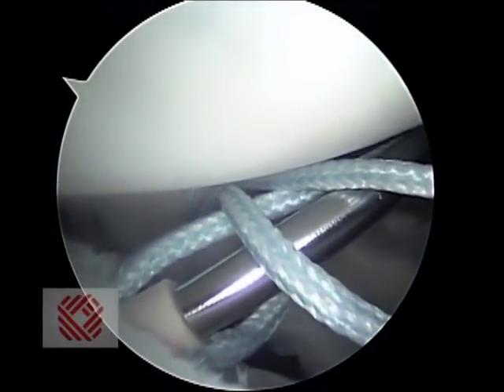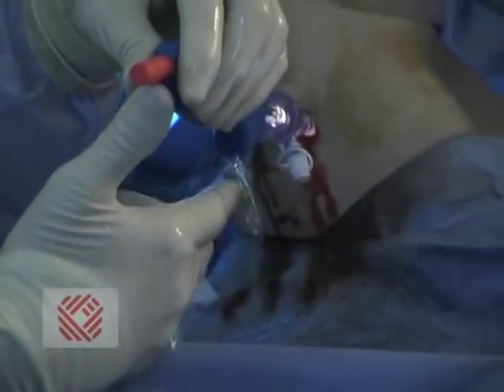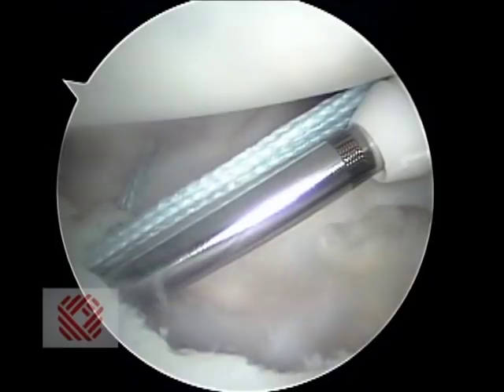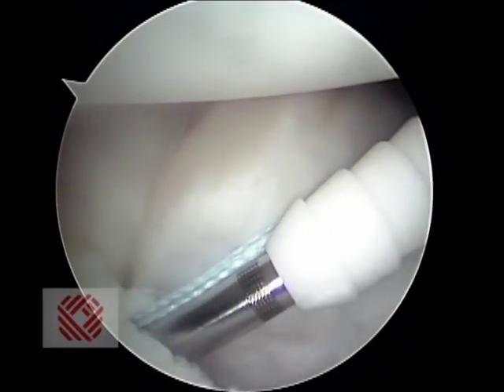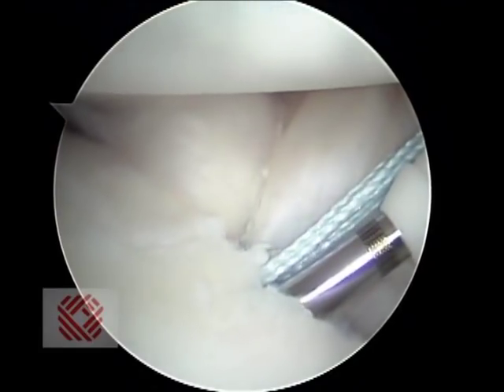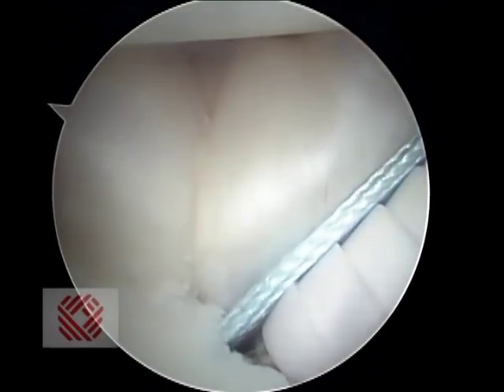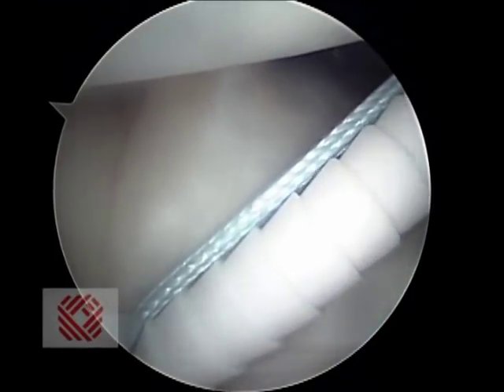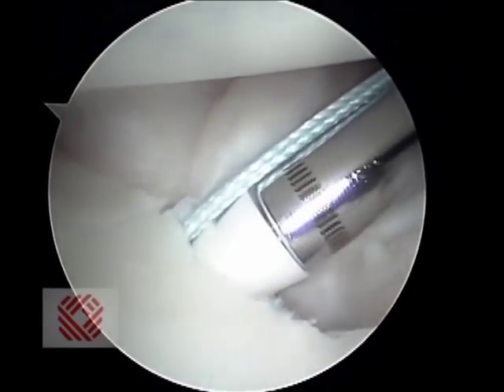Now we tension this — this is the critical part. We're just about to tie this down, and we want to pull our suture up. See how that's cinching in? That's why they call it a cinch lock — I can control that tension beautifully. I'm looking for that pleated tissue. I'm holding the suture in one hand and putting the implant up, setting the implant tension, and now placing that implant in. This fellow has good bone — textbook.